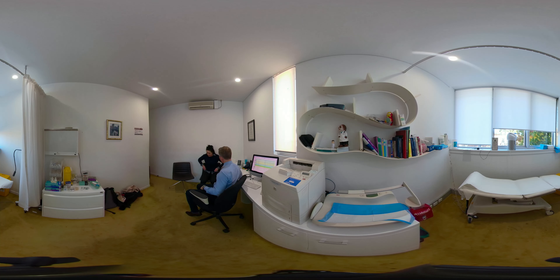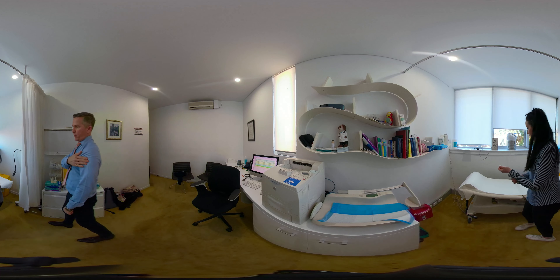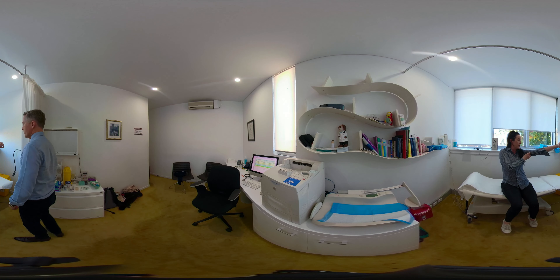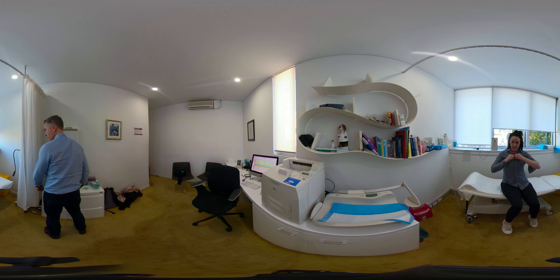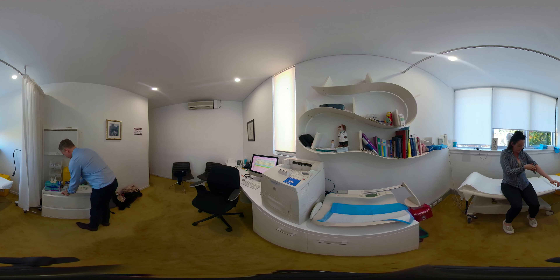What I'll get you to do is probably take your jumper off and come over and have a sit up on the couch. You just have a sit up there. I just want to get up to the top of your arm, so I'll let that go up. If you don't mind, just pull your arm out. I'll just get everything ready.